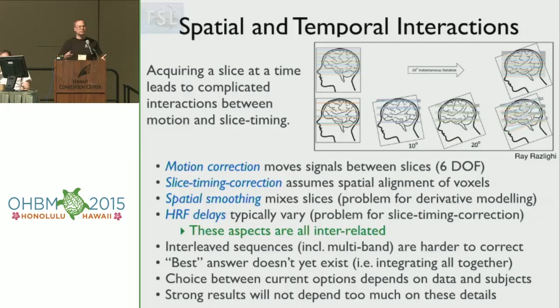And there is, as I said, a whole range of data out there. There's no single best answer in a lot of these cases, and this is one of them. Different data sets will have different degrees of goodness of doing one order versus another order. And it's going to depend on the nature of the data itself, the nature of the motion which was going on, and the kind of analysis that you're going to run on it later on.